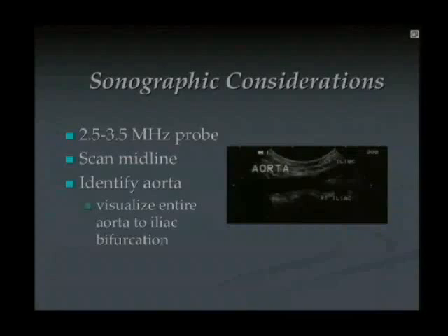We're going to use that same probe, 2.5, 3.5 megahertz. We're going to scan in the midline, again from the epigastric area right on down to about the umbilicus, and we're going to scan in a sagittal plane and in a transverse plane.